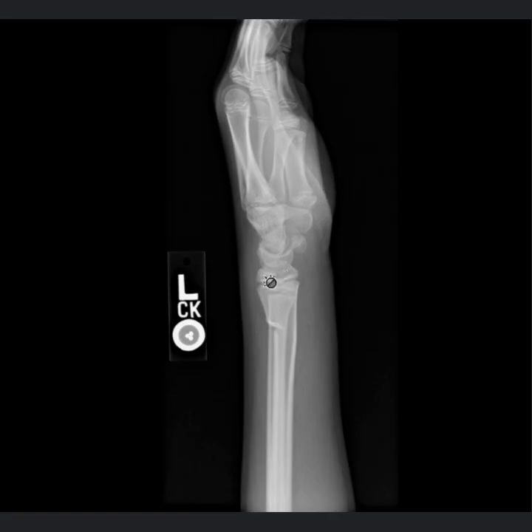So oftentimes what I'll have the cast techs do is put the cast on and leave it pretty wet. In these casts, especially an older patient, we'll do a monster cast or a bit of a long arm cast. And then as the cast is drying, I'll try to reduce the fracture a little bit and mold that fracture into a good position to try to prevent further loss of deformity and maybe even correct some of the loss of deformity that was there.